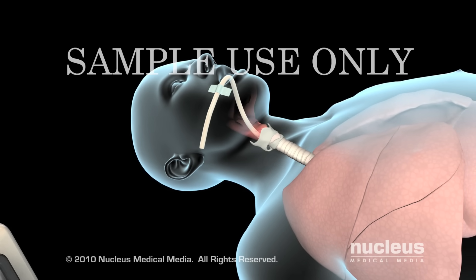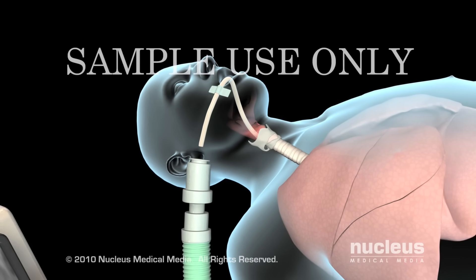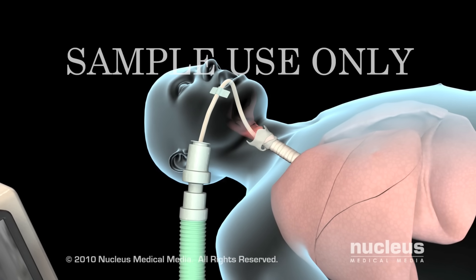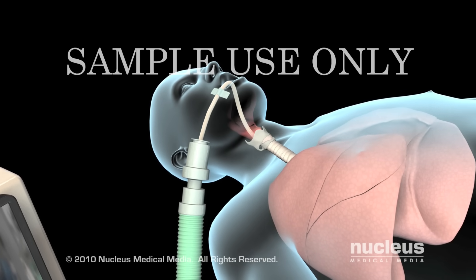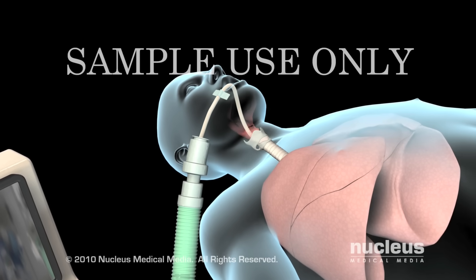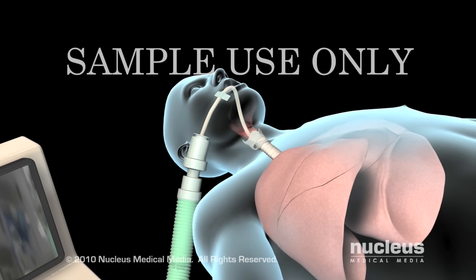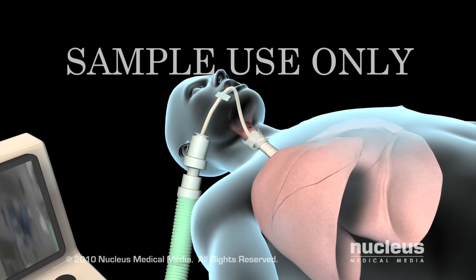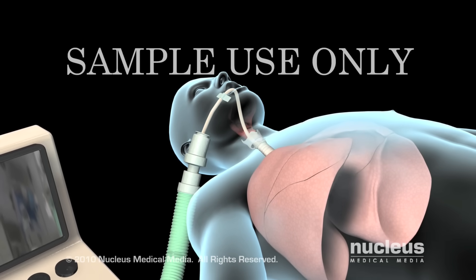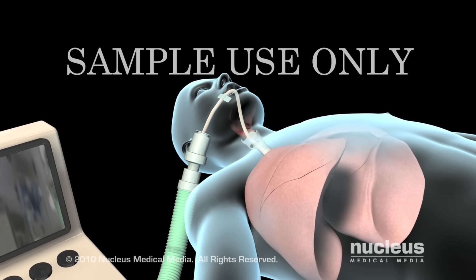Once the endotracheal tube is in the proper position, your doctor will attach it to the mechanical ventilator, a specially designed pump that aids respiration by delivering well-oxygenated air into the lungs and permitting carbon dioxide to escape from the lungs. Levels of oxygen and carbon dioxide will be closely monitored to confirm that the ventilator is working.